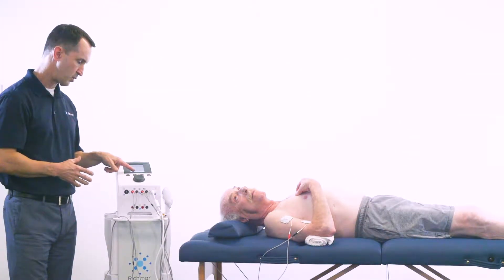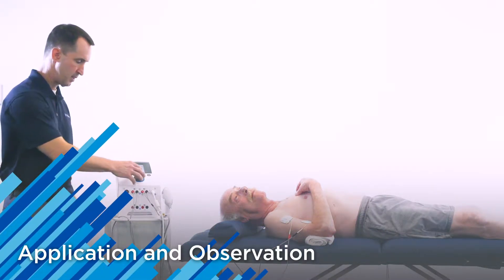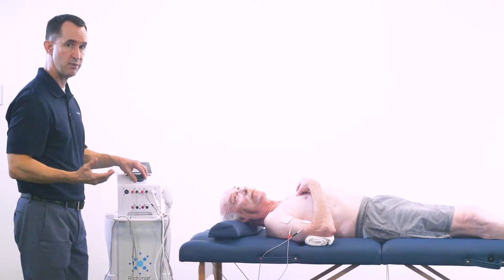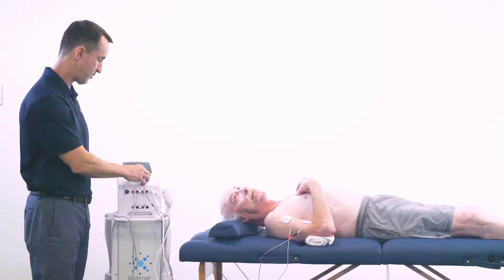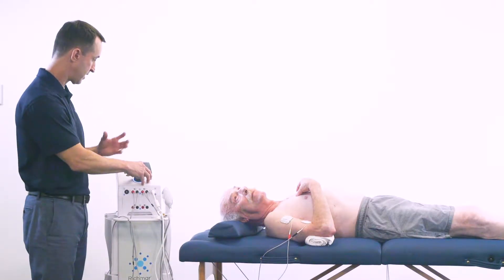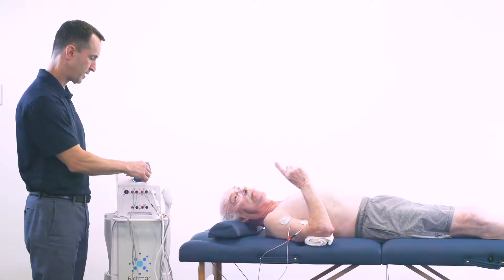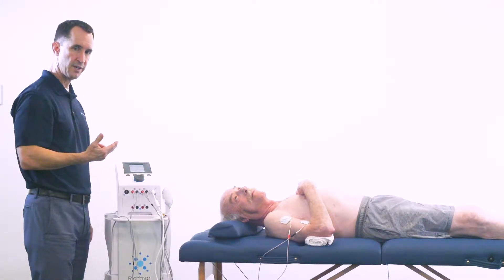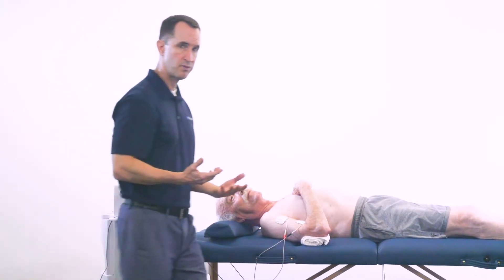I'm simply going to touch the screen where the milliamps option is, highlight it, and now I'm going to increase the amplitude to a sensory level stimulation. I'll have the patient let me know when they start to feel that stimulation — that sensory tingling sensation. And because we're in a continuous mode, the timer has already started, so now I can go ahead and transfer over to the stool.